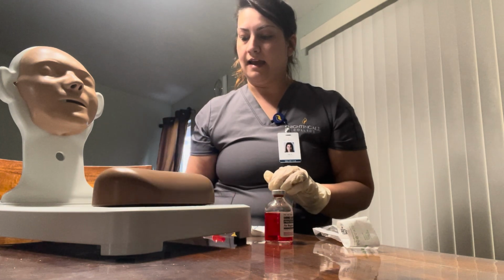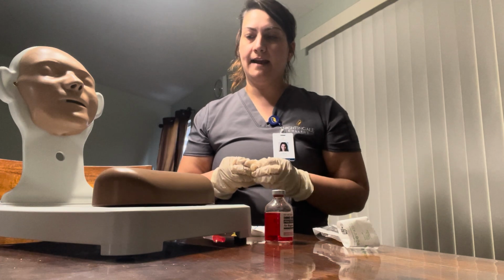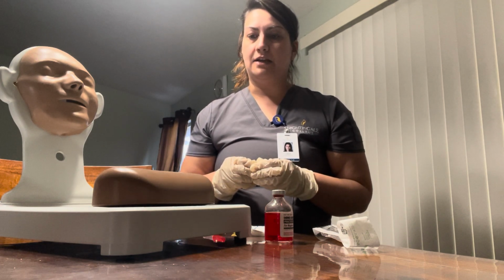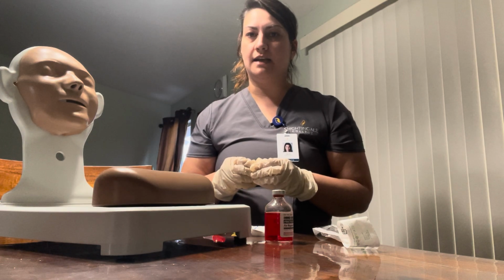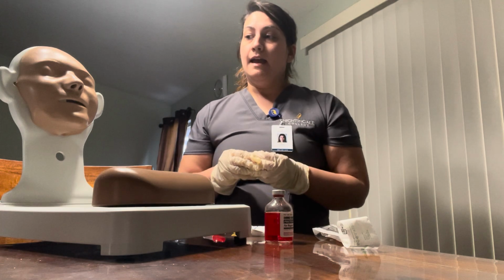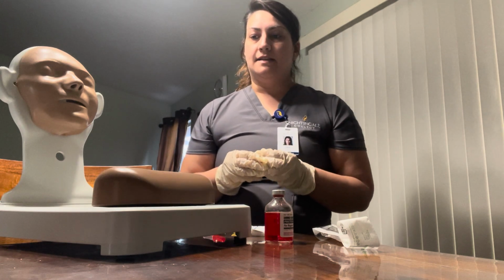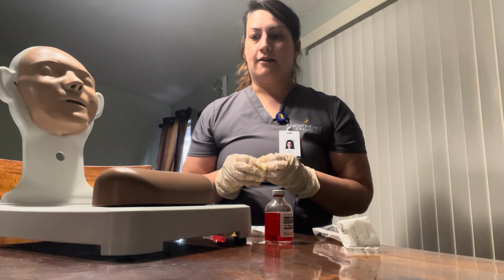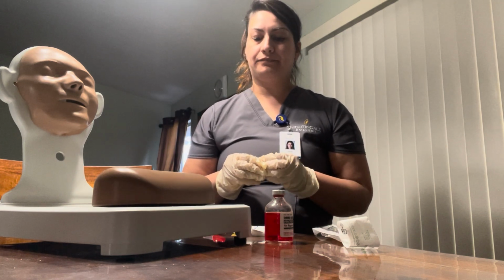Next, I am going to assess the site. Usually for subcutaneous injections, the patient gets it in her upper arm, abdomen, or the thigh. In this case, our patient, due to rotation methods, is going to get her injection in the abdomen.